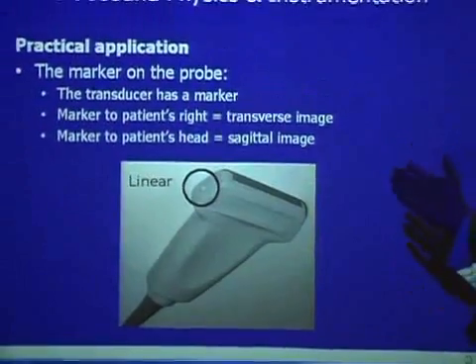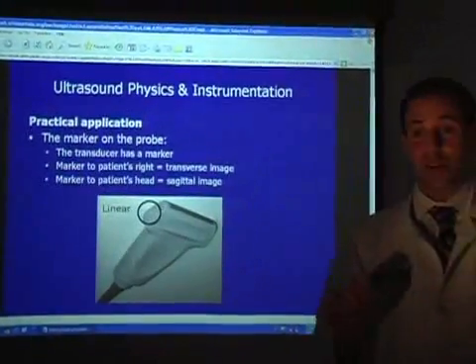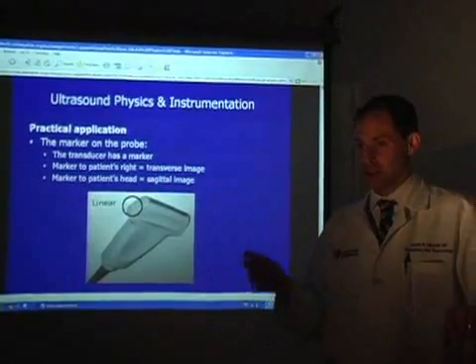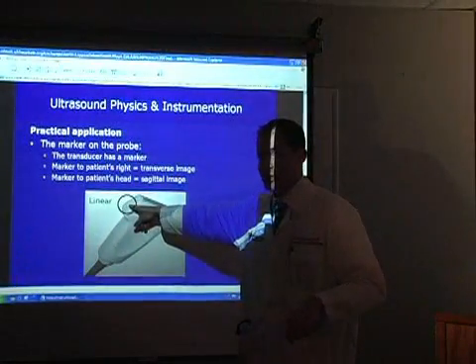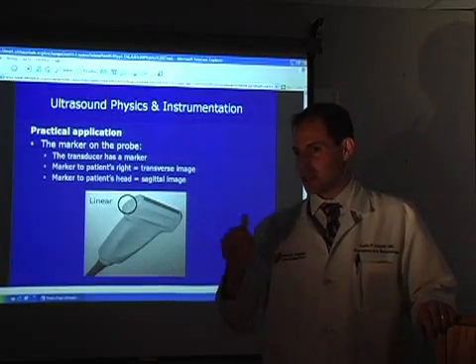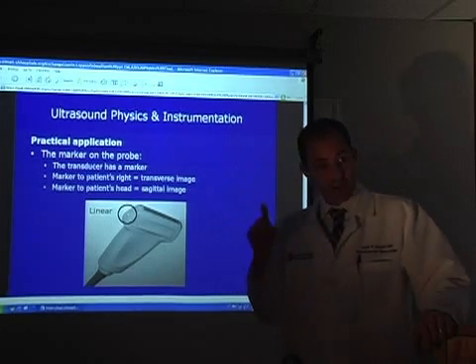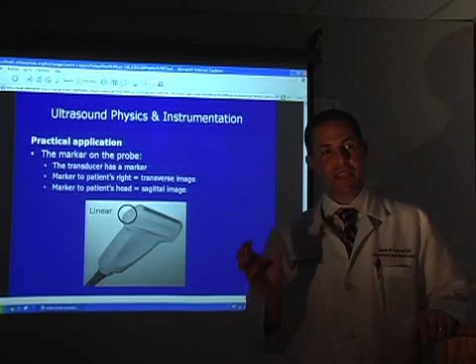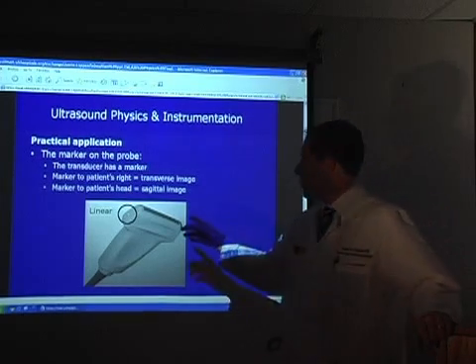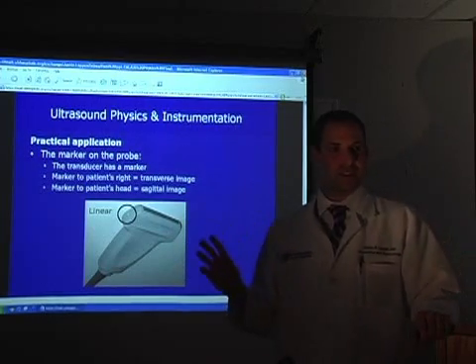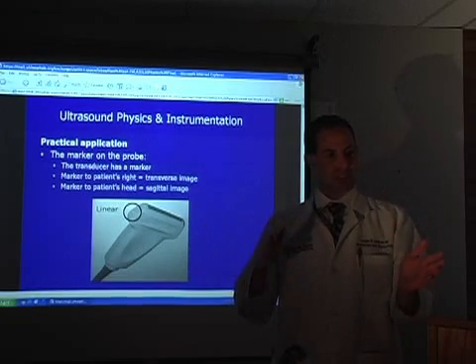Every ultrasound probe — whether linear, convex, or transvaginal — has a notch or marking on it. This is a linear probe with a long thin footprint. There's a little notch or dot on the probe; sometimes it's palpable, sometimes it's a color-coded button. It's important to know where that marker is because it orients your probe in your hand to the screen. That notch or marker always corresponds to the left side of the ultrasound screen, so wherever that dot is physically placed will portray on the left side of the image.